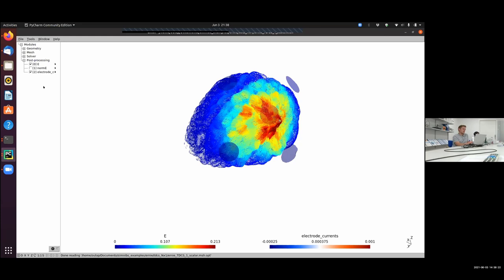And this is very, very complex, and I think what Andreas Vlachos has shown today is a first attempt to also model this on a single neuron level initially. So this is not yet something which is easily available, and is still, I think, a little bit earlier in research. So far you only get electric field strength information out, and what the neural effects then look like, and because only those would differ between the different rTMS protocols, this needs additional information, because then you have to run neural simulations. I hope that answers this a little bit.